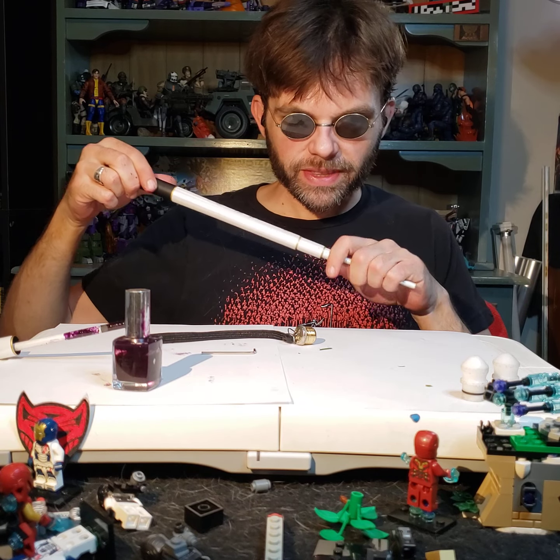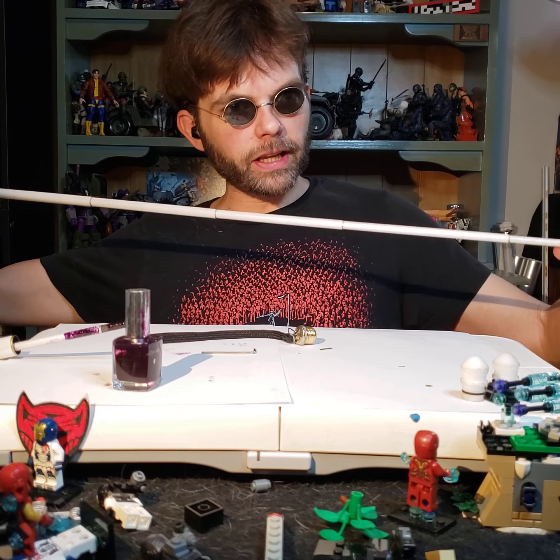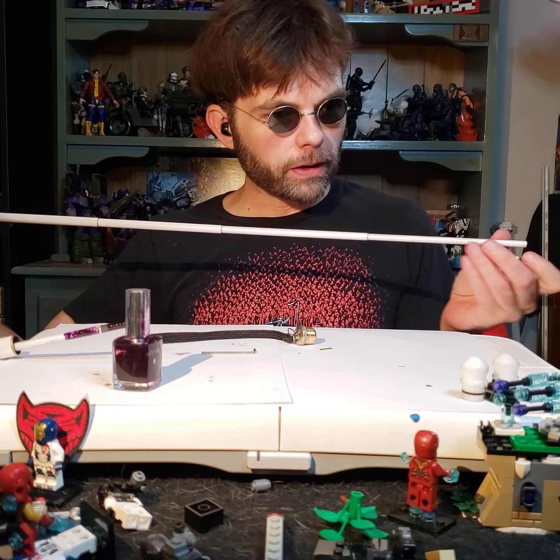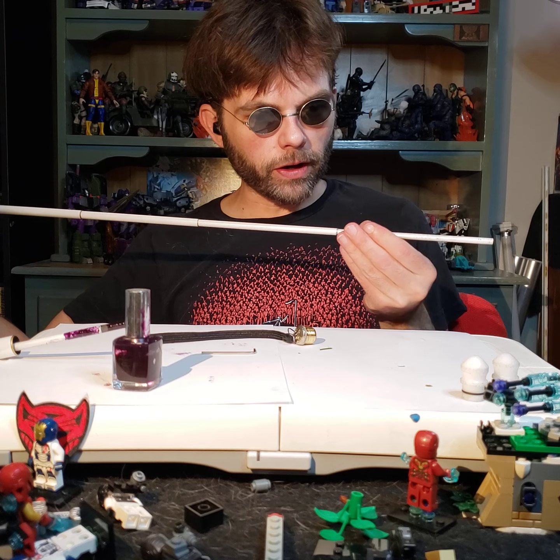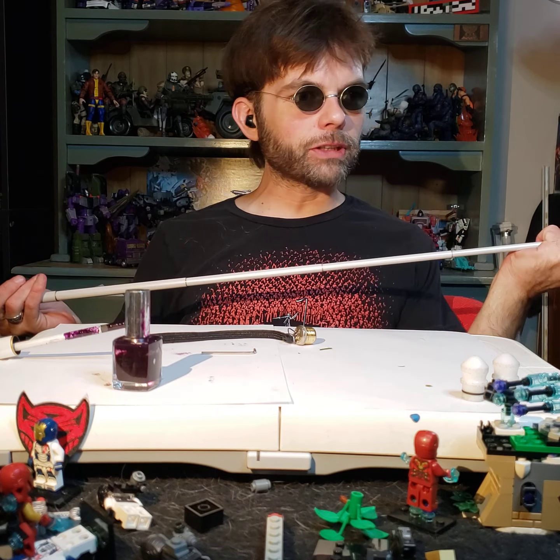Okay, let's pull it down and see if it sticks. If it sticks, we succeeded. If it comes out, we failed. Okay, here is the test. Look at that. That is stiff. It's rigid. It's exactly what you want in a cane.